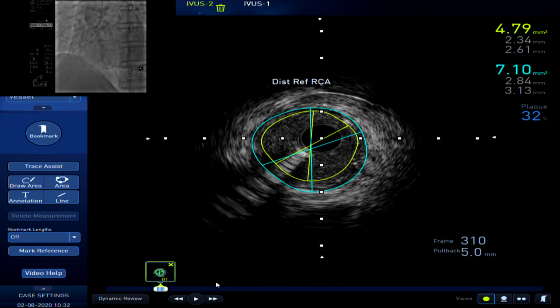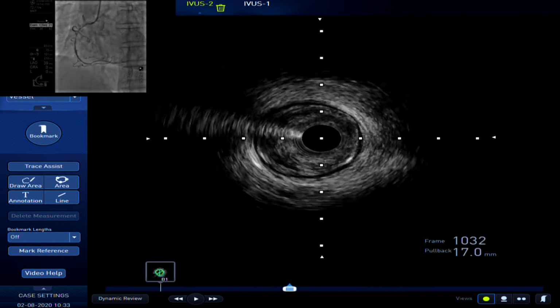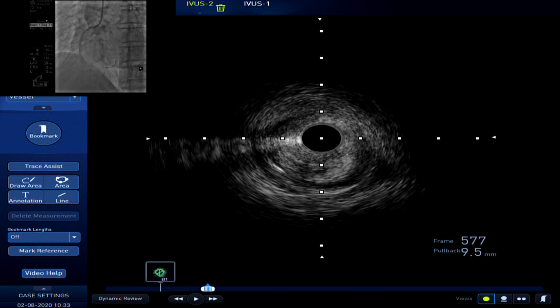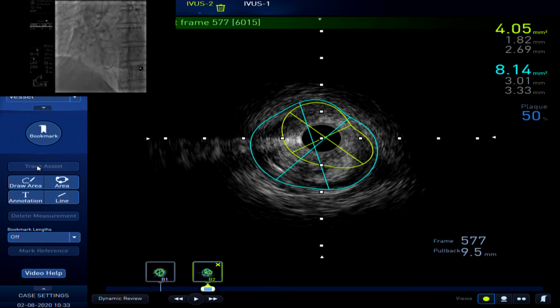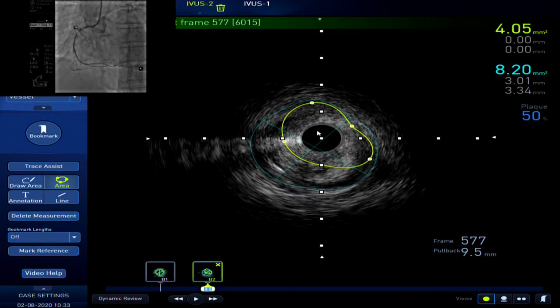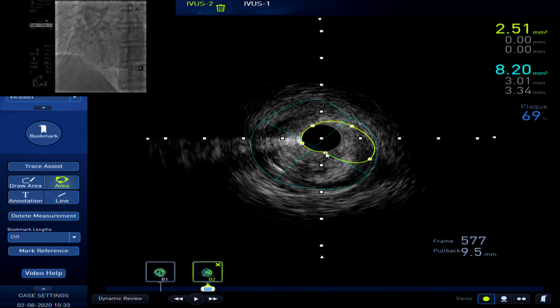In Japan, you have the 48 millimeter stent. Yes. And in India, you have a 48 millimeter stent. 48 millimeter? Oh, yeah, we have it. Even 45, 48 is fine. Just one, 48 is good.